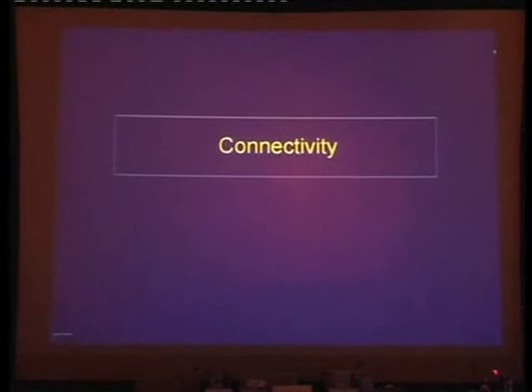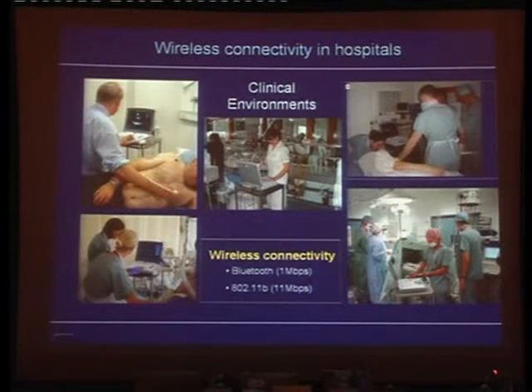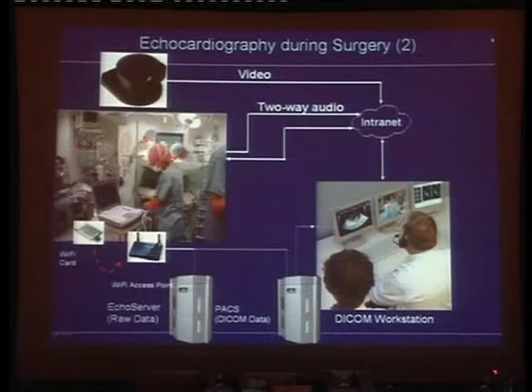It should become part of our curriculum. Connectivity is another problem in the hospital. In some hospitals we already have wireless connectivity, and all the different areas where echo is useful, like the baby intensive care unit, the lab, and the surgical theater, can all be interconnected so that you can work with a few experts. I think that's how it works in the Mayo Clinic.